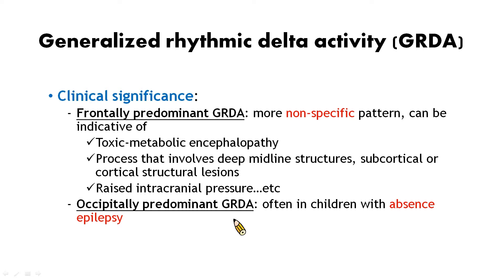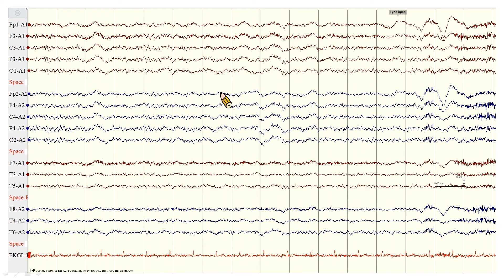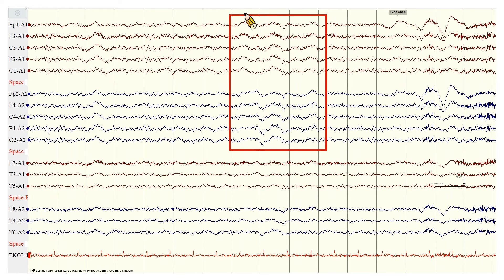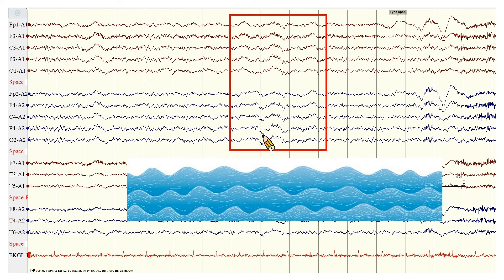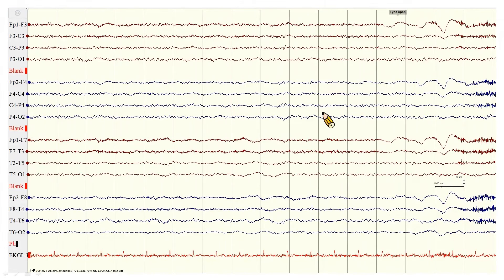OIRDA is more often seen in children with absence epilepsy. In this A1-A2 montage EEG, we can see rhythmic delta activities over bilateral hemispheres — this is an example of GRDA. The delta activities are synchronized, perhaps more synchronized than expected. However, when we change to the double banana montage, the GRDA appears offset.